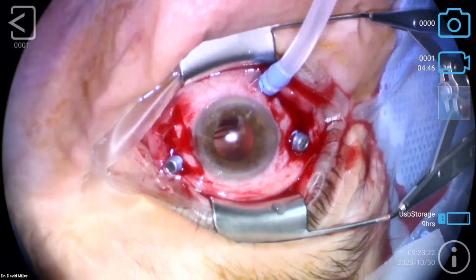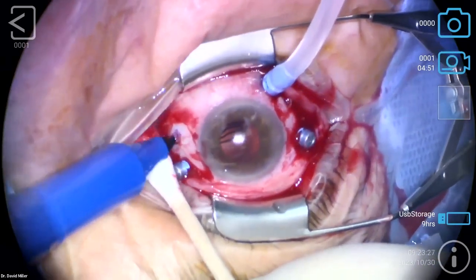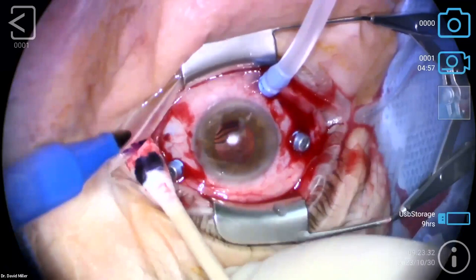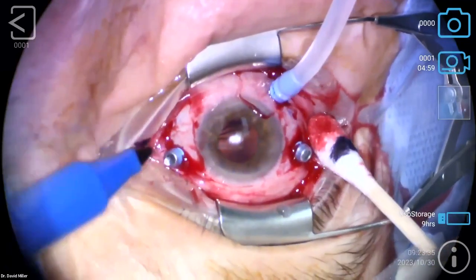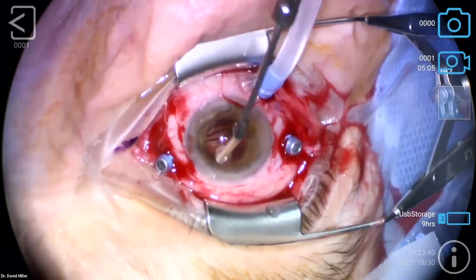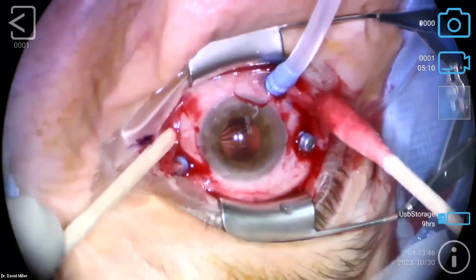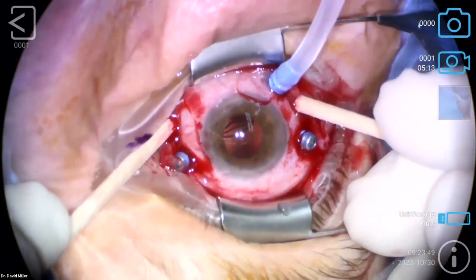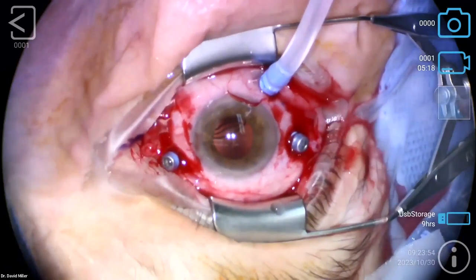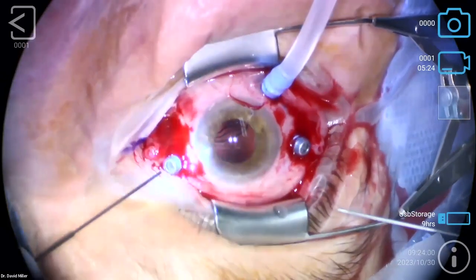So once we have all the incisions in, before we throw any sutures at this guy, we want to make sure everything looks about symmetrical. So if you go like this real quick, take a look at how the eye is set up. You got these two across from each other, these two right here and right here across from each other, and that passes the eyeball test. It's pretty much right on without getting too measurement obsessed.